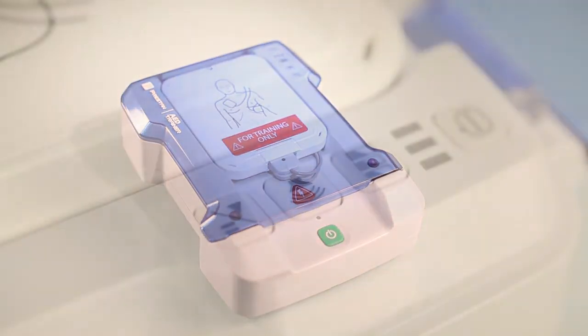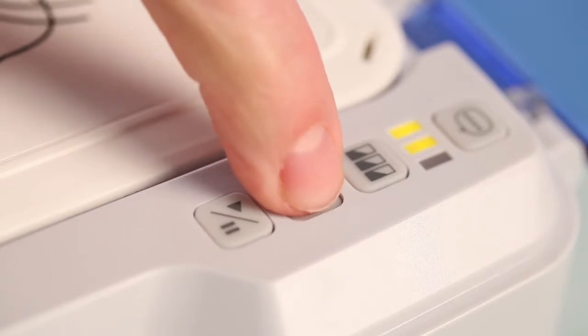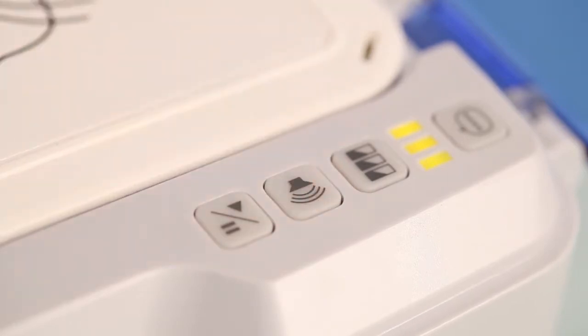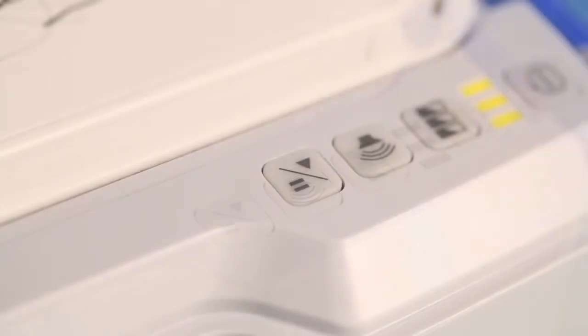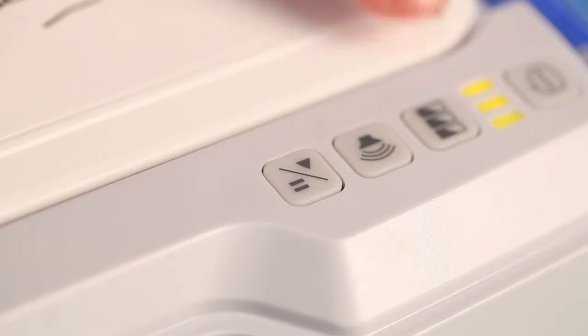There are three levels of volume on the AED trainer. The last button is the play/pause button. When the button is pushed the unit will pause the scenario. When in pause mode the three yellow indicator lights will blink. To resume play simply press again.